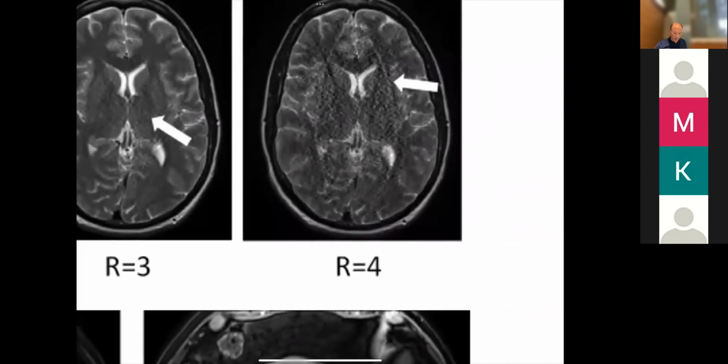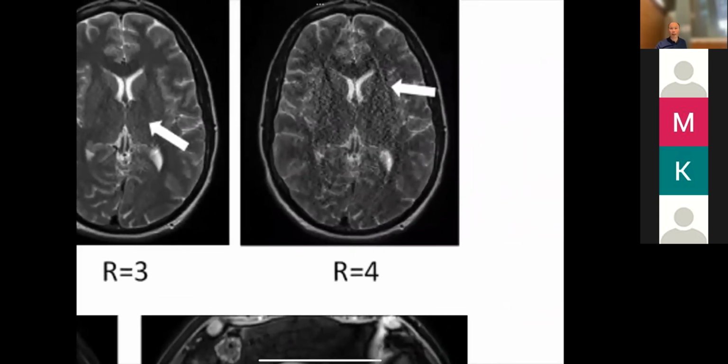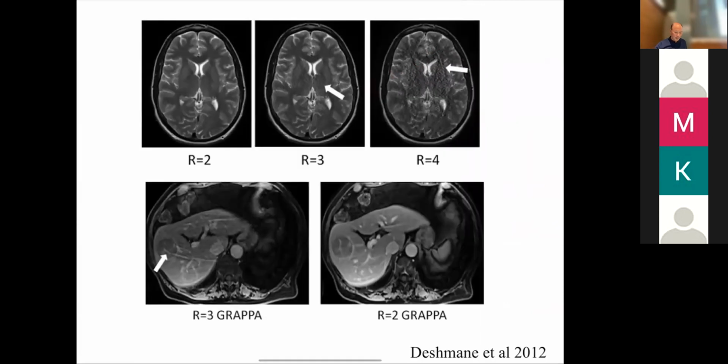And you can sort of see here, it really is falling apart quite a lot. Okay. So in this part, because probably the coils aren't set up correctly, you're just getting a lot more noise amplification. And so the trade-off as an engineer or a physicist is you're always trying to figure out what is the fastest you can push, right?